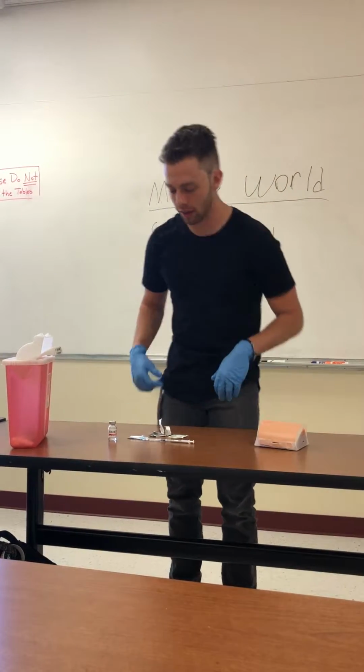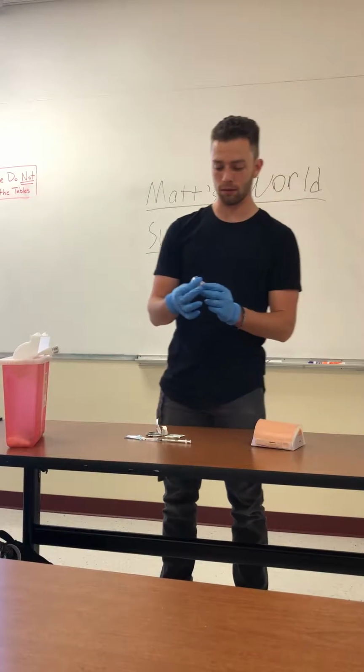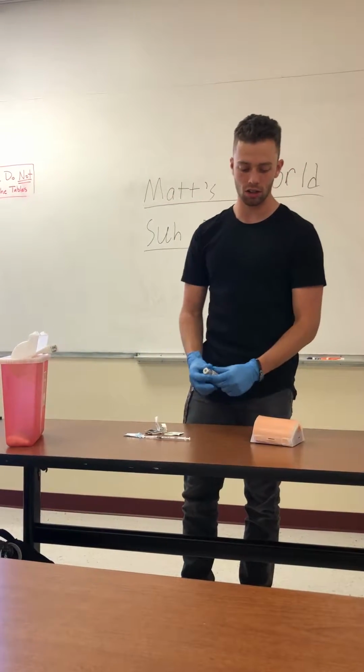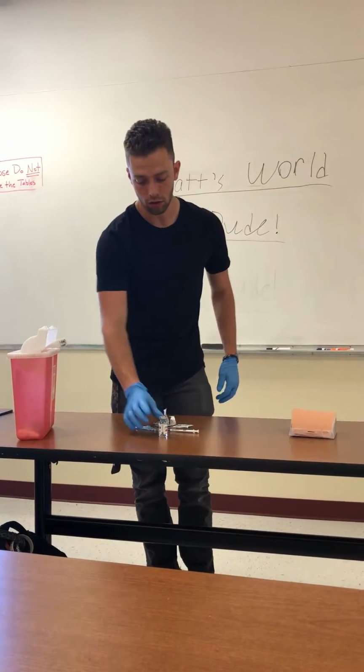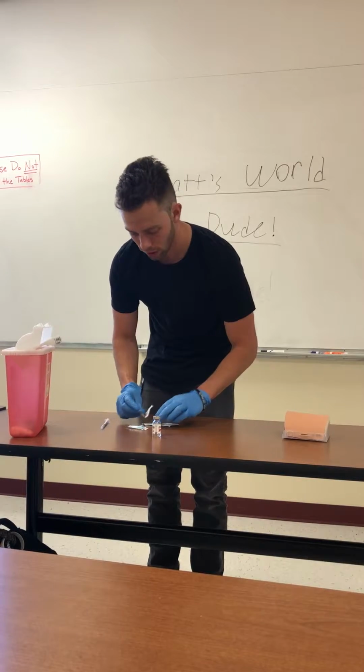Now, at this point, I would have wanted to check my medication 3 times. Once when I draw it out of the Pyxis, once when I'm drawing it up in my syringe, and once right before I give it to the patient. Now, let's jump into doing things with the vial.